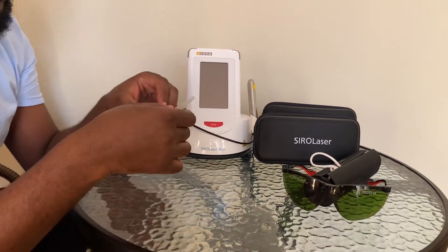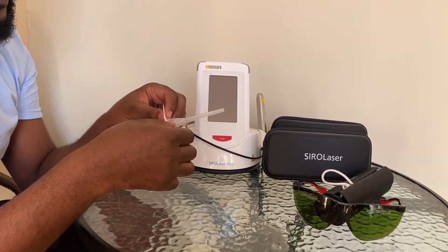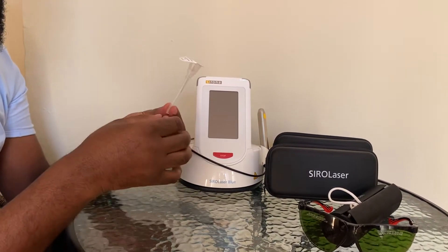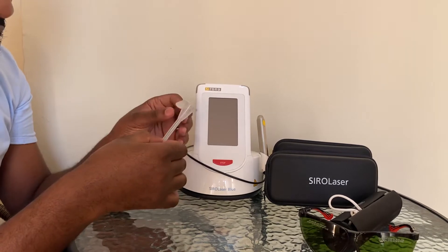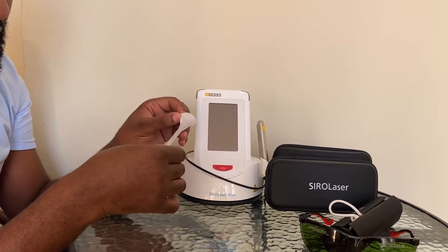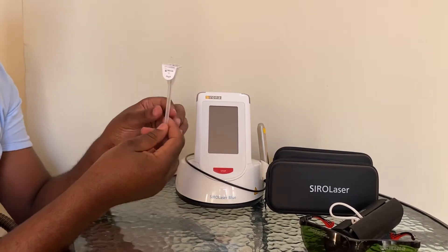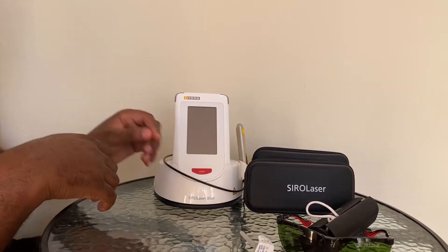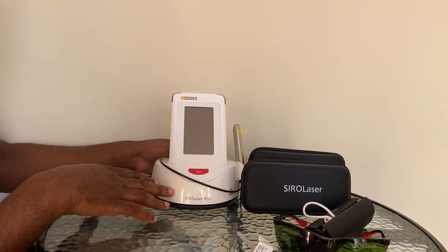The other important thing when using lasers is the laser tip. Depending on what application you want to undertake, you will have to choose a laser tip appropriately. So to start the machine, we press start.